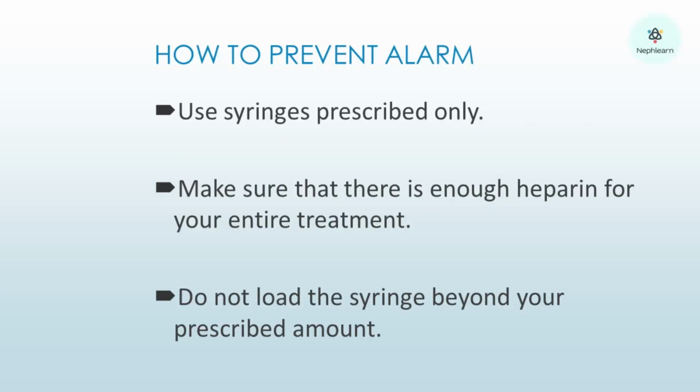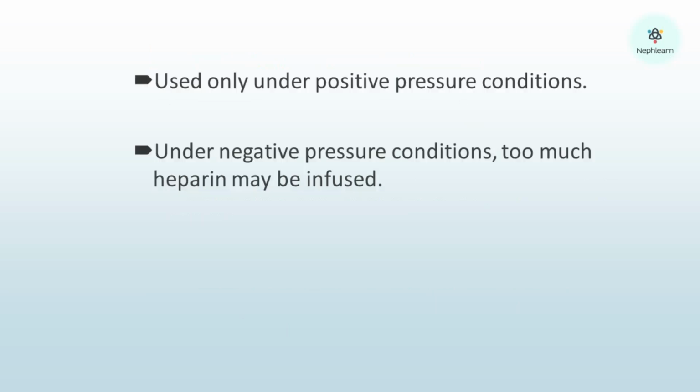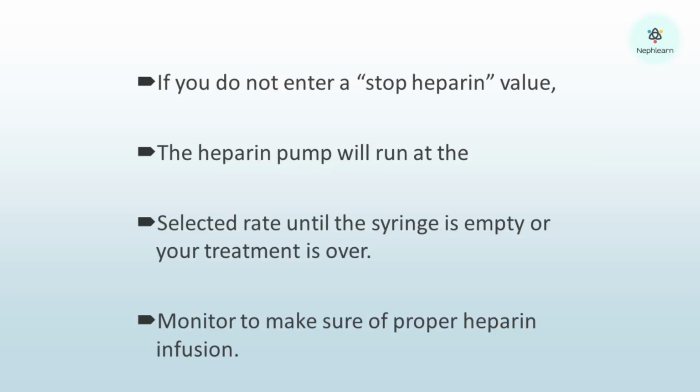Only use the syringes compatible with the heparin pump module. Make sure there is enough heparin for the entire treatment and do not load the syringe beyond the prescribed amount. The heparin pump is to be used only under positive pressure conditions. If we do not enter a stop heparin value, the pump will run at the selected rate until the syringe is empty or treatment is over. Monitor carefully.